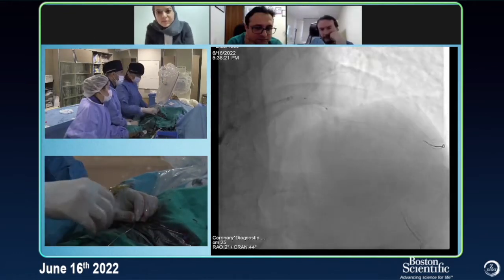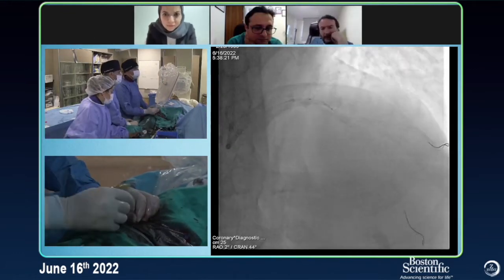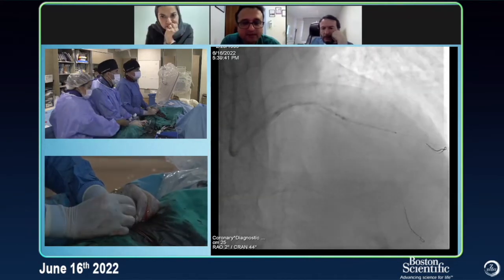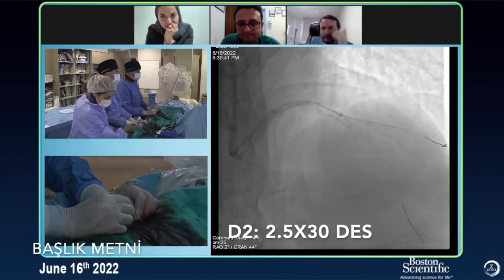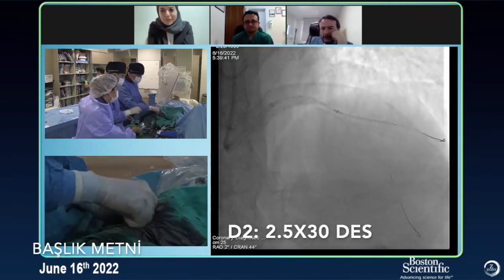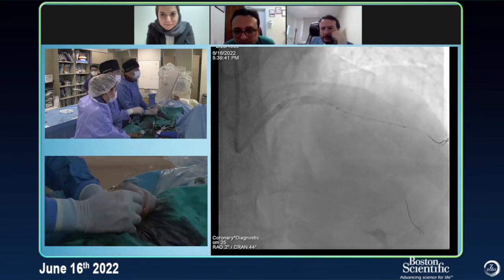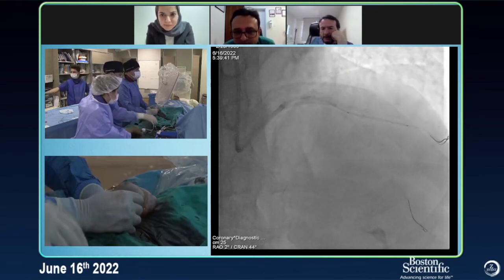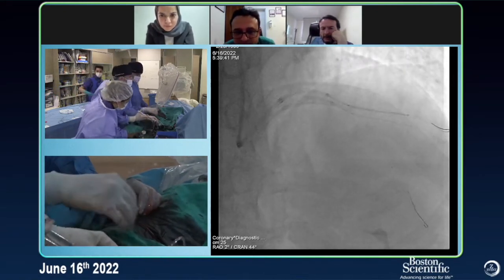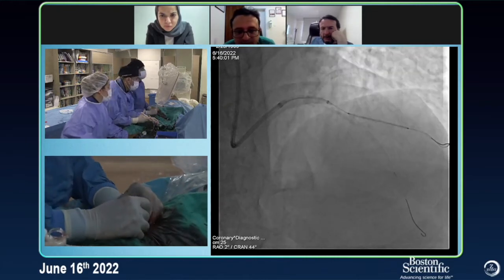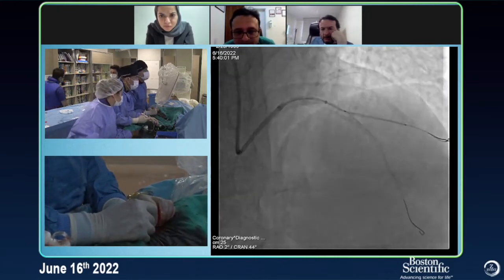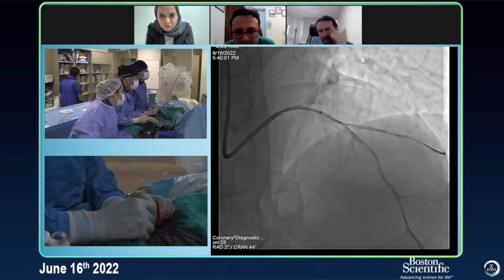What size stent are you using? 2.5. Small injection. We have dissection there — very gently. All right, this is nice. Good opening.